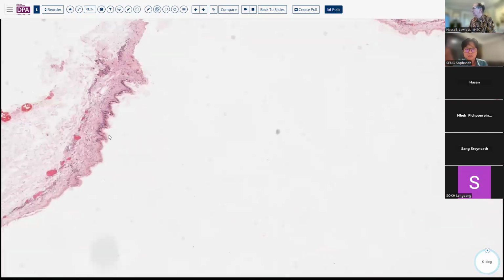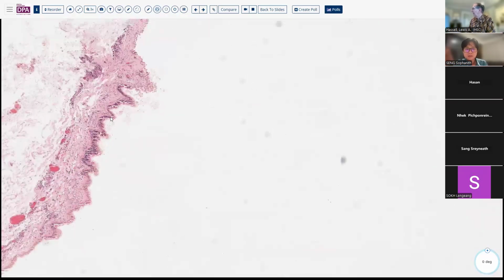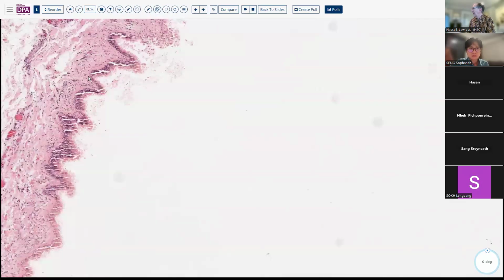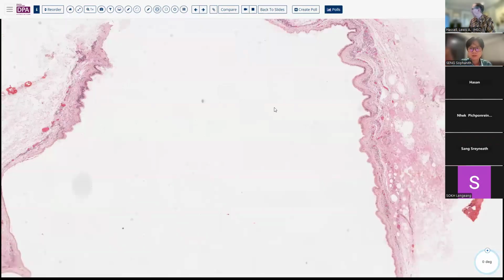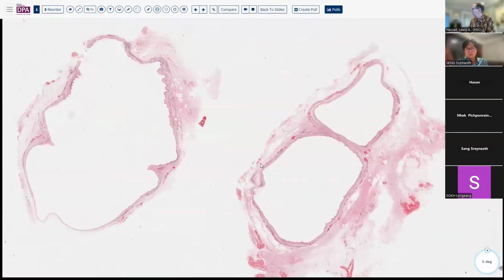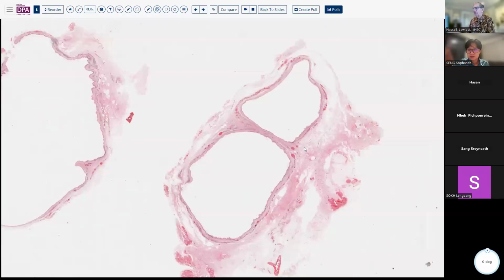And they can be this type of cyst, which as you see here has a more columnar type lining. And I think we can come in here and you can imagine that there's some cilia here. You can see a few terminal bars. And so this is ciliated respiratory type epithelium, and that helps to define this lesion as a bronchogenic cyst. As you can see, there's no cartilage, but there can be variable amounts of cartilage and adnexal glandular tissue that can develop in these as well. It just depends upon how much of that embryologic remnant has become associated with that.